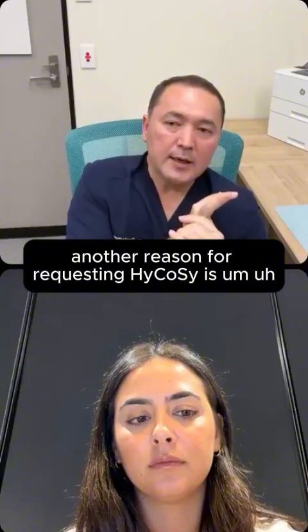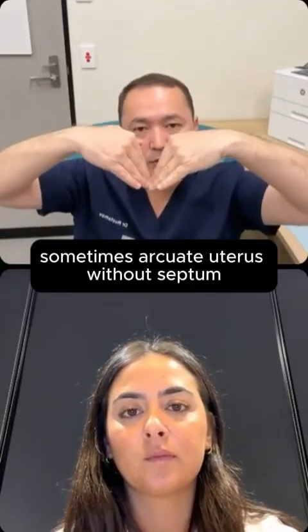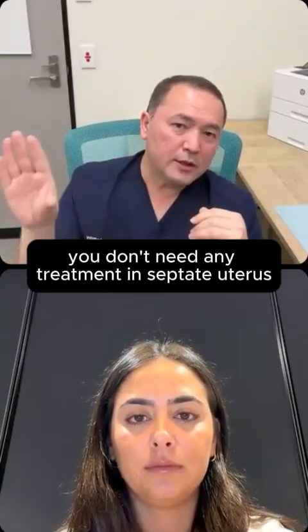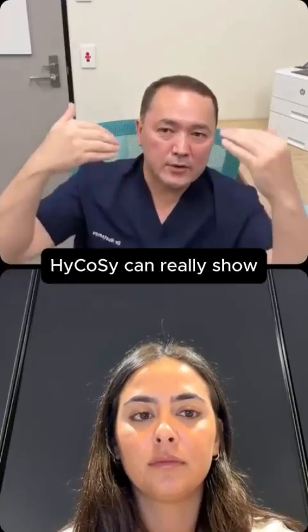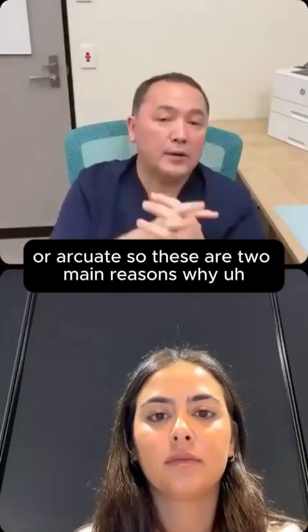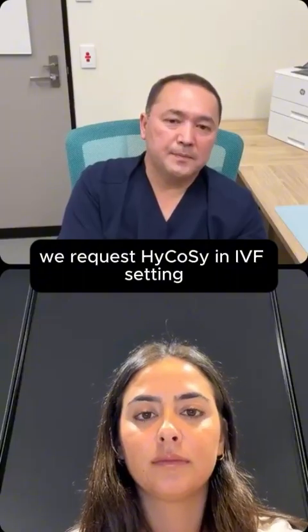Another reason for requesting HyCoSy is diagnosing uterine abnormality. If you're not quite sure whether there is a septum or not, sometimes an arcuate uterus without septum can look like a septate uterus. In an arcuate uterus, you don't need any treatment. In a septate uterus in IVF, you want to remove the septum before doing embryo transfer. If you're not quite sure, then HyCoSy can clearly show whether there's a septum or whether the shape of the uterus is bicornuate or arcuate. So these are the two main reasons why we request HyCoSy in the IVF setting.